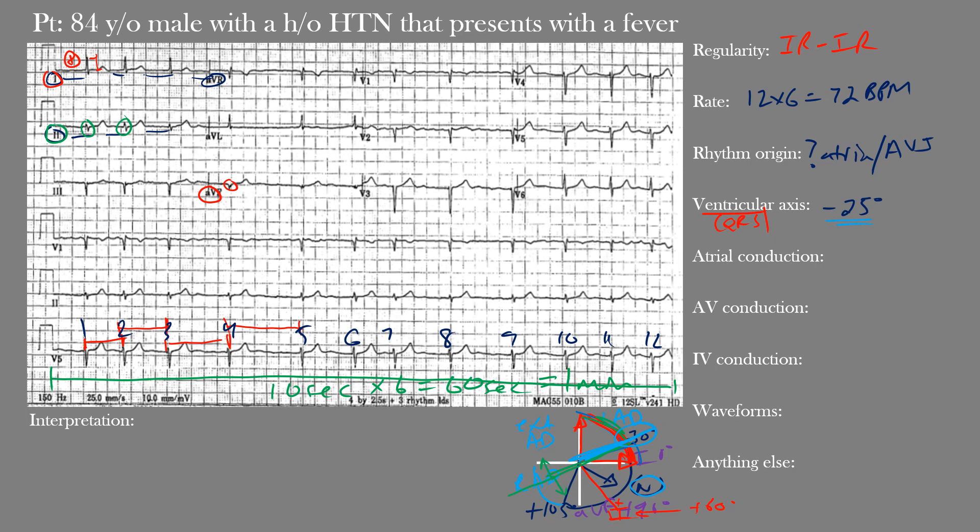For atrial conduction, we can't make out any P waves, which represent atrial depolarization, so there is no clear atrial conduction. For AV conduction, again no clear P waves means no clear PR interval or PR segment, so no good evidence of AV conduction. For intraventricular (IV) conduction, the QRS duration should be between 70 and 110 milliseconds — about two to three small boxes. Here we have narrow QRS complexes within normal limits; the QRS duration was 88 milliseconds, so IV conduction is normal.